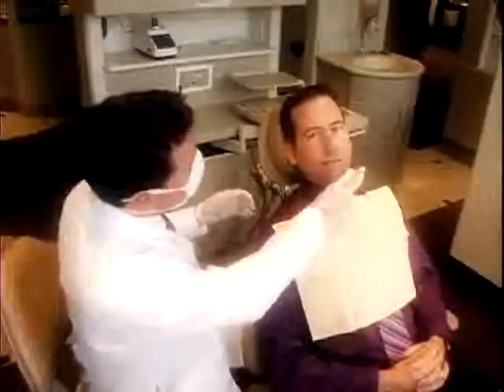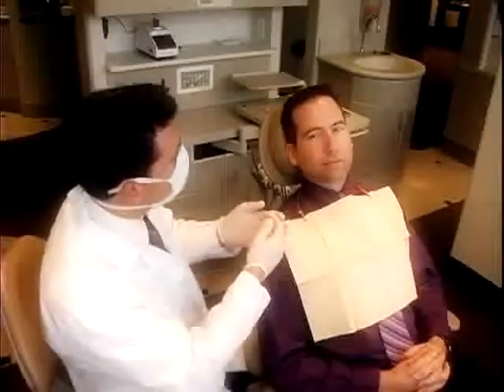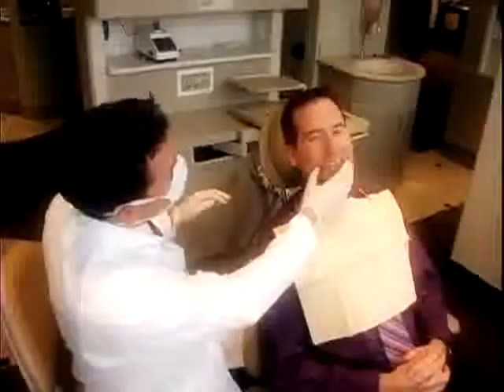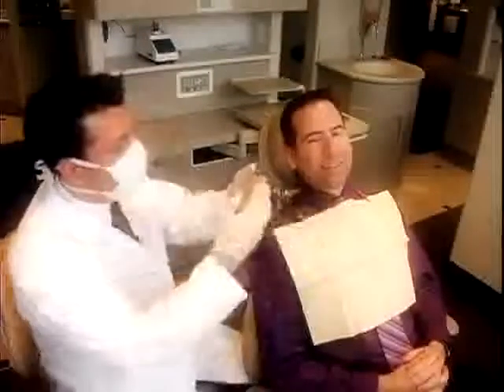One of the key considerations when considering cosmetics is how it is going to influence the patient's smile overall. We need to take into account his coloration. For example, Randy's eyes are green. His coloration of his hair needs to balance along with the eye color, cheekbones, and shape of the chin. I'm going to have Randy smile big. We'll note that Randy has a smile that ranges quite nicely, and we'll be able to bring the coloration and a true full smile out with him with this simulation and, of course, the final results.